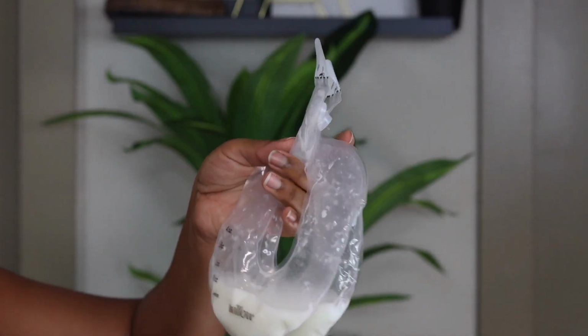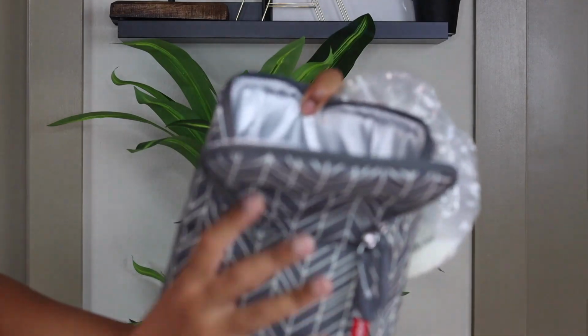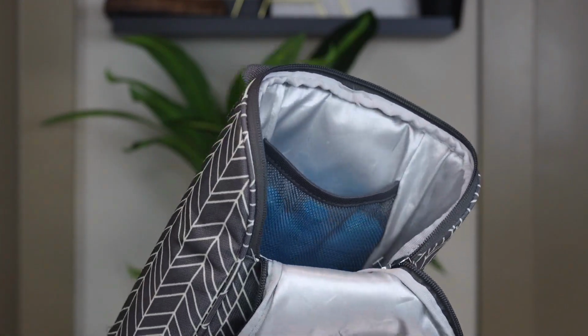Then of course, after you're done pumping, you can take the bags out, and if you're on the go, you can put the bags either in some type of lunch bag with ice, or you could just place it in your refrigerator.